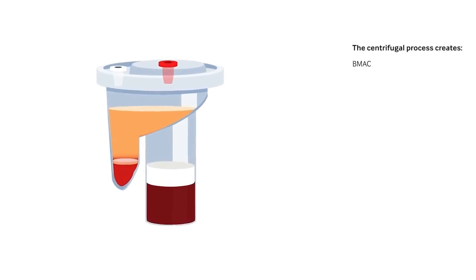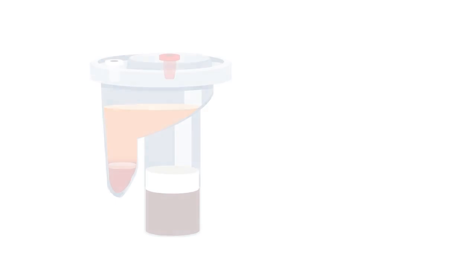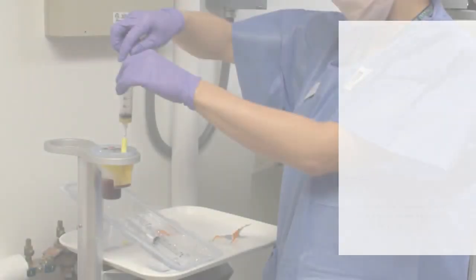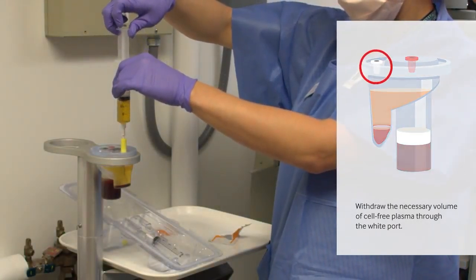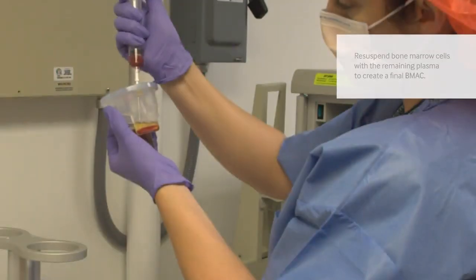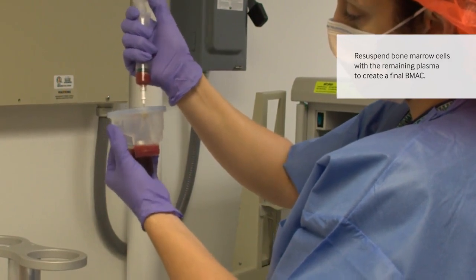When the system stops, the result is 4 to 20 milliliters of concentrated bone marrow aspirate. Using a syringe with one or two yellow spacers, withdraw the necessary volume of cell-free plasma through the white port. Re-suspend bone marrow cells into the remaining plasma to create a final BMAC.